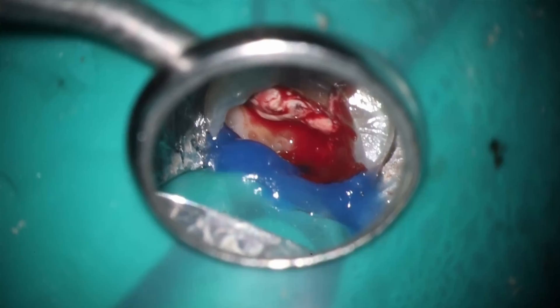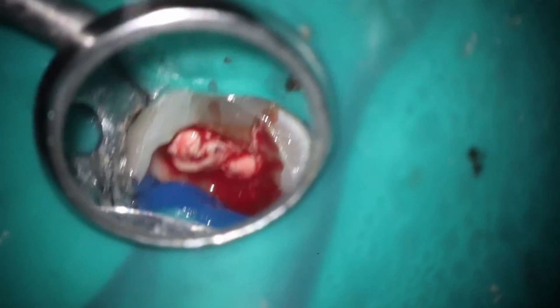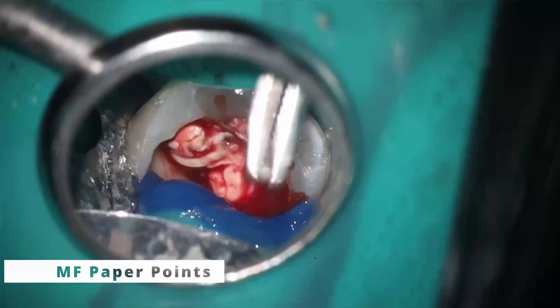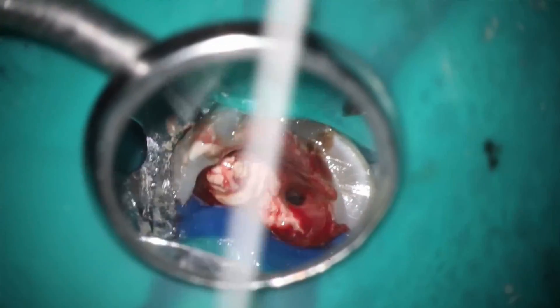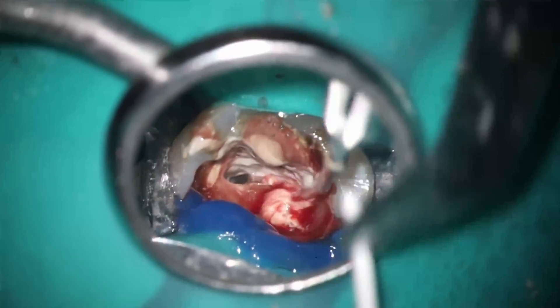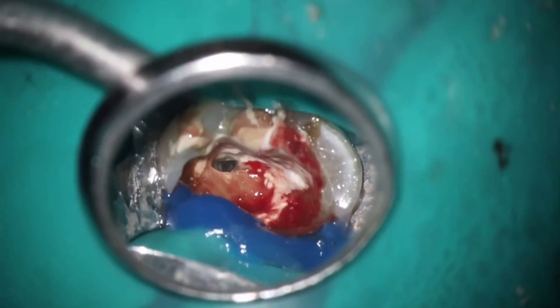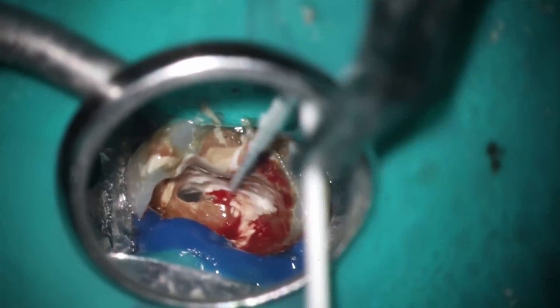So what you then do — as you can see, it's just soaking inside there. The assistant gets your paper points ready. I like to use the medium fine, a little bit thicker, because you're going to be recapitulating up and down like that. The calcium hydroxide, because it's very basic, is going to help coagulate the tissue down inside there almost immediately. And you can see that excessive bleeding that was starting there has already stopped.